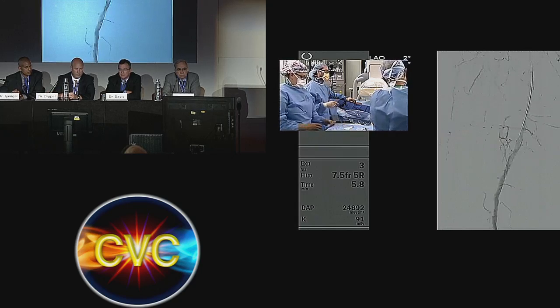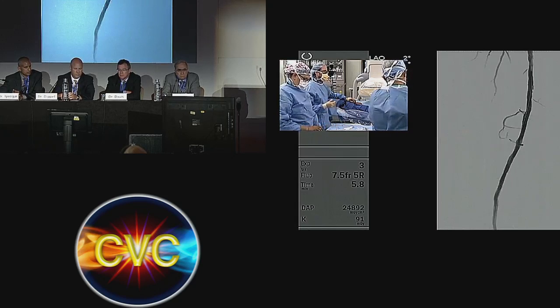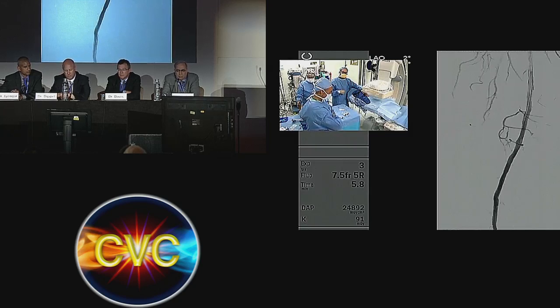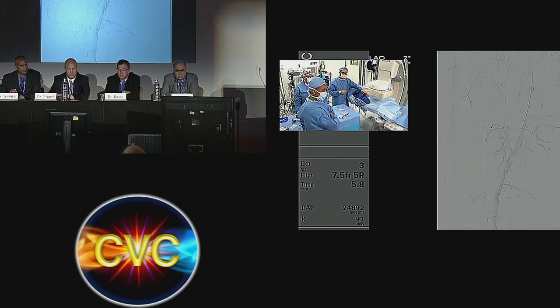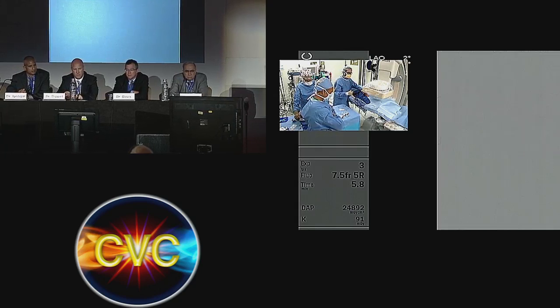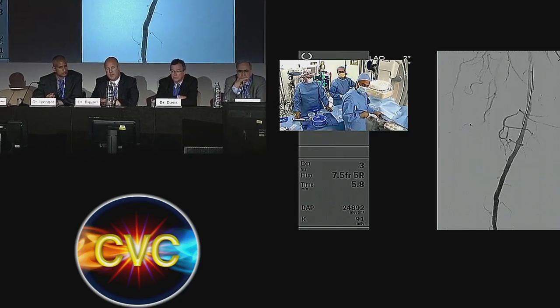My reason is knowing that with any procedure that you do proximally, if you improve the outflow, our long-term results tend to be better. So I don't think that by treating that anterior tibial, I'm going to cure him. I probably think that by doing just this very simple balloon angioplasty, this guy will probably feel much better. But I would like him to have longevity of this procedure, associated with whatever I do, with a better outflow. I agree with that statement completely.